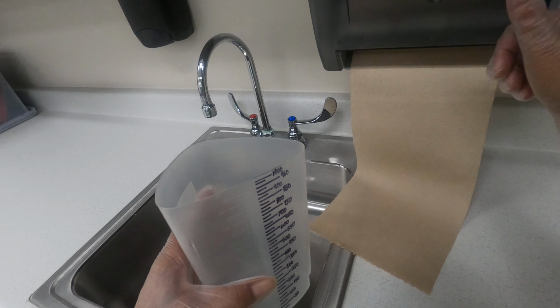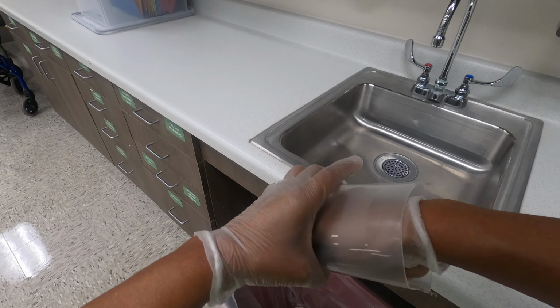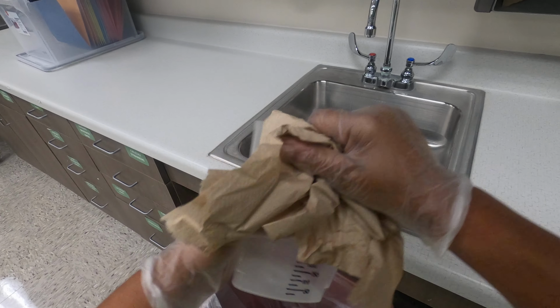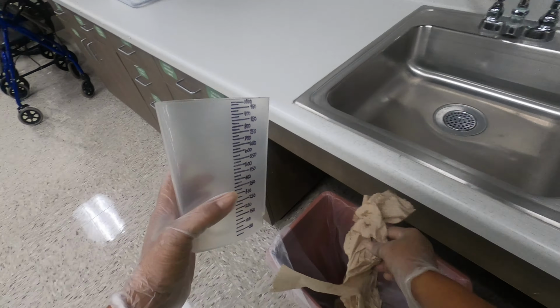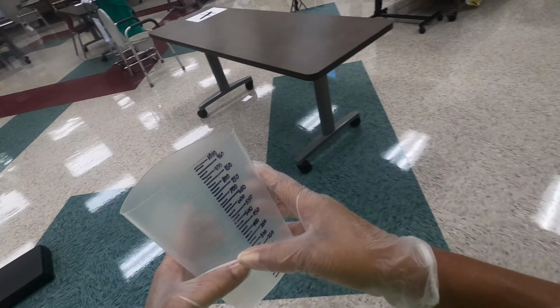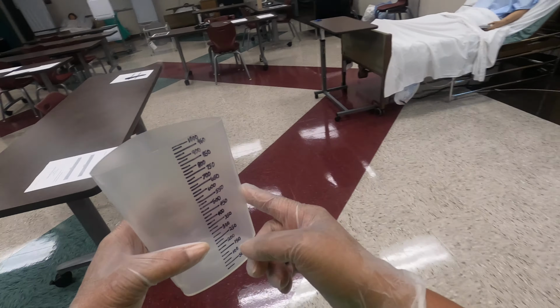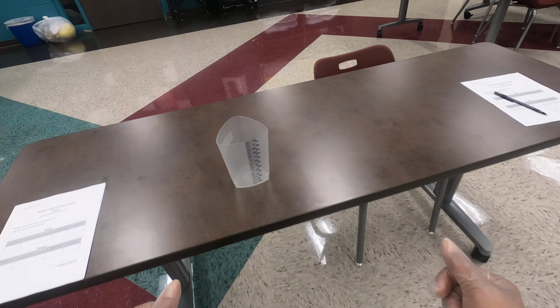Then you'll need to dry out the container. Okay, so I just got some paper towels and I'm drying out the container inside and out. I'm going to throw that paper towel away. Then I'm going to place the used measuring container back on the designated dirty table.